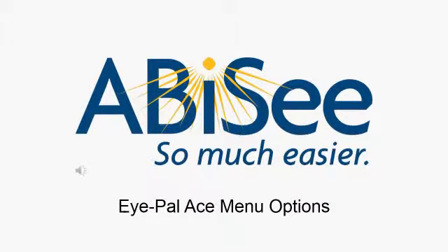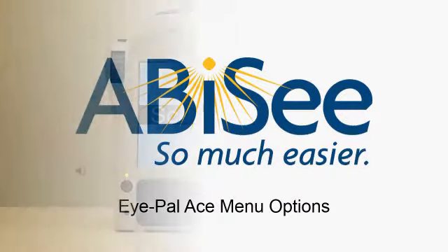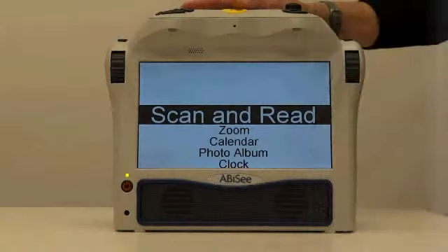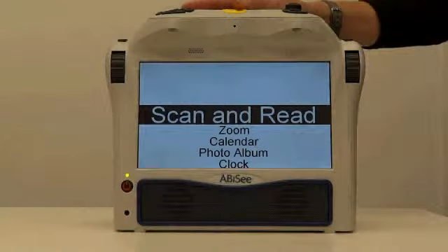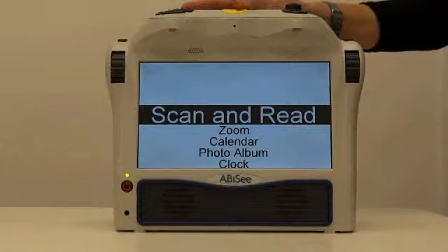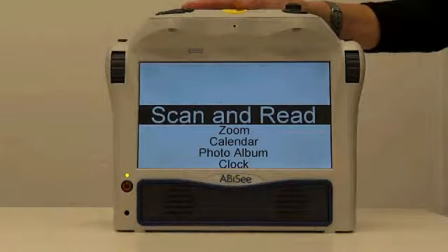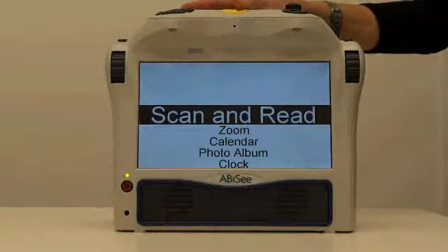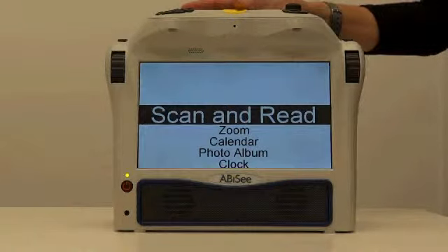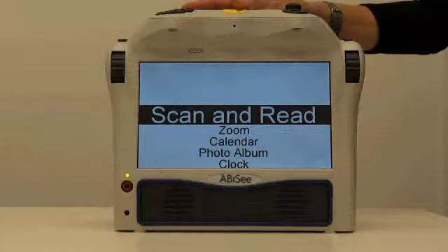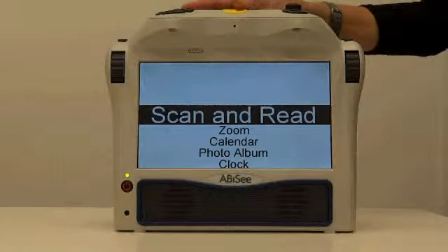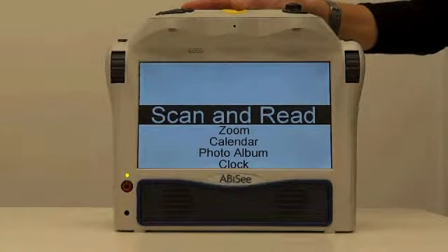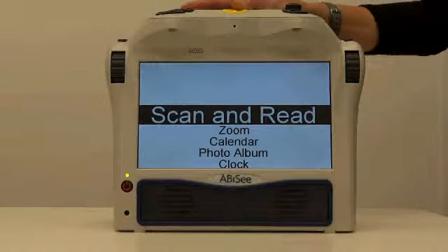IPAL ACE Menu Options. When the IPAL ACE powers up, it brings you to the main menu screen. This video will introduce you to the main menu.